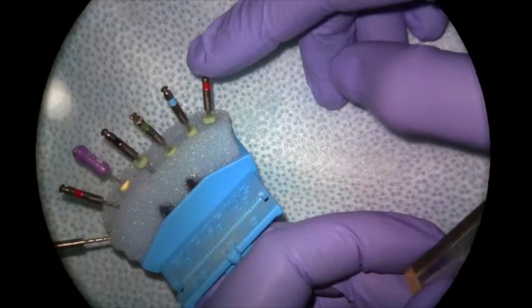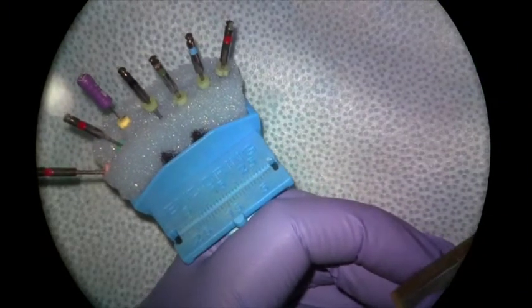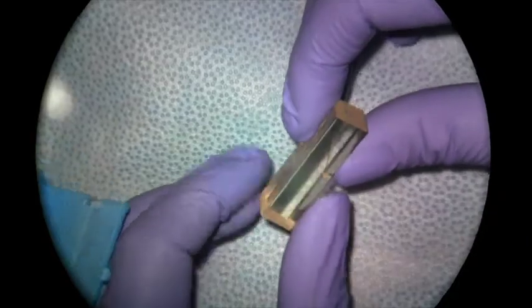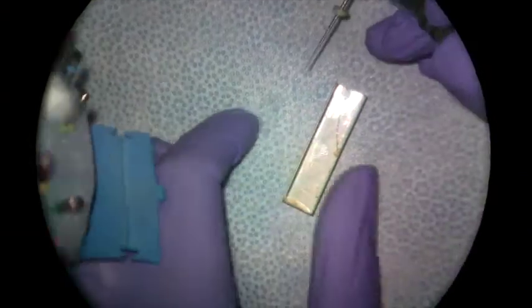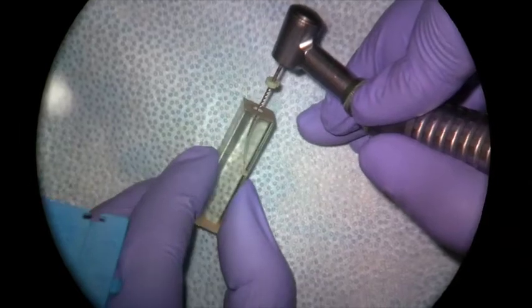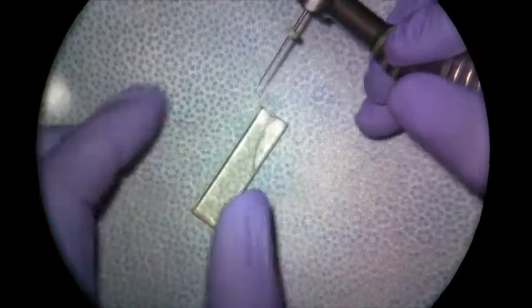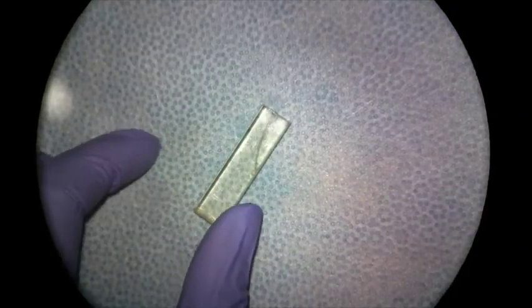Now that I've made space coronally, I'm going to start with my 04 series, working from the 40 down to the 25. This is a crown-down sequence, as we explained in lecture — you're not expected to get to length with the larger files initially, you're just working your way down toward the apex. I'll go with my 40.04, measure it to my corrected working length of 17, place it in the canal with just light apical pressure to resistance. I didn't get all the way to my length — still a few millimeters short — but that's okay; I'm just making space coronally.